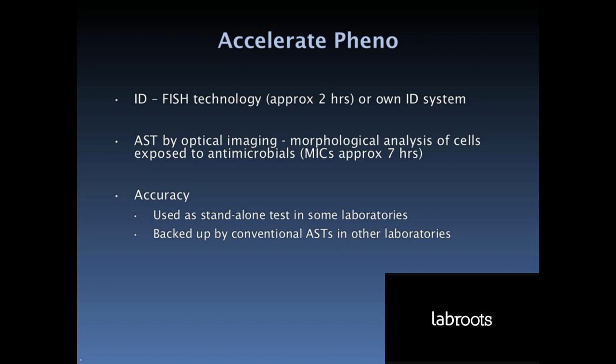This raises the issue of whether early antibiotic susceptibility results are okay to report for serious infections if there is uncertainty about their accuracy. No susceptibility test is perfect, but some tests are unacceptably error-prone. So the thing to determine is if the accuracy of the Pheno is acceptable for your laboratory.